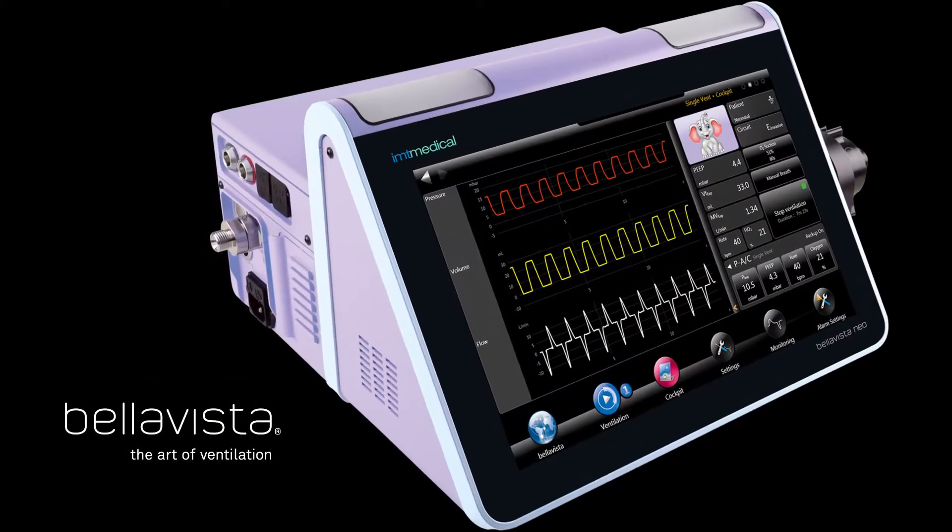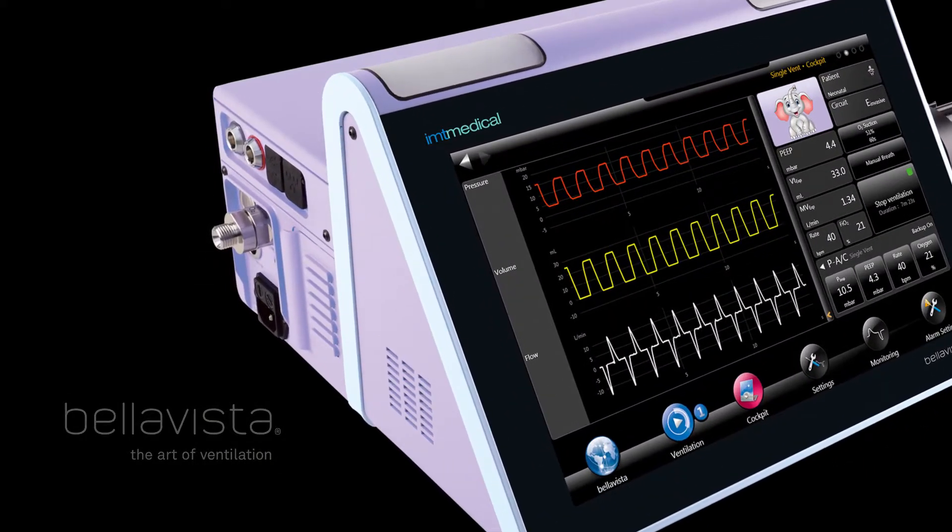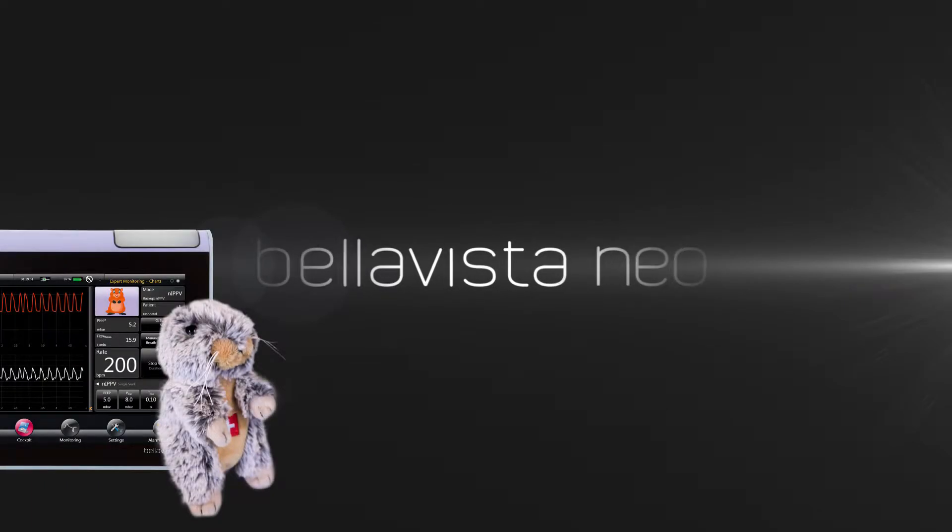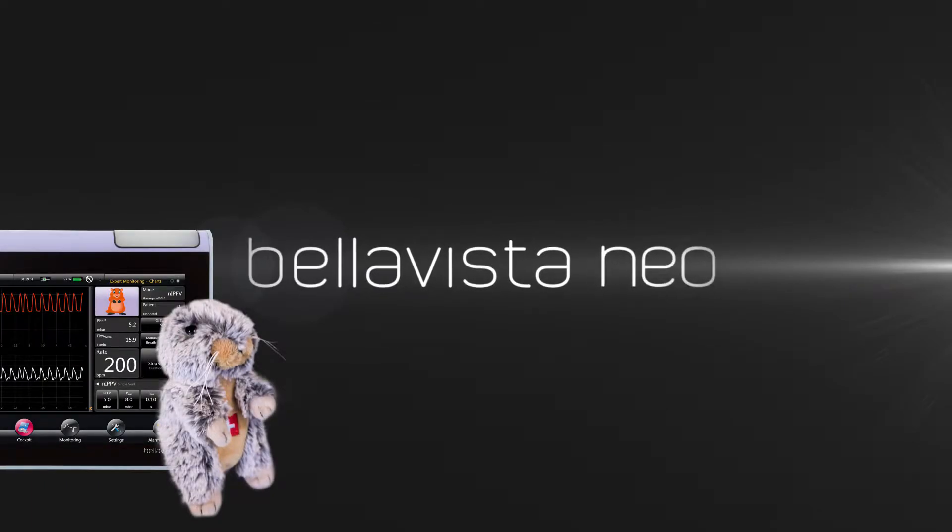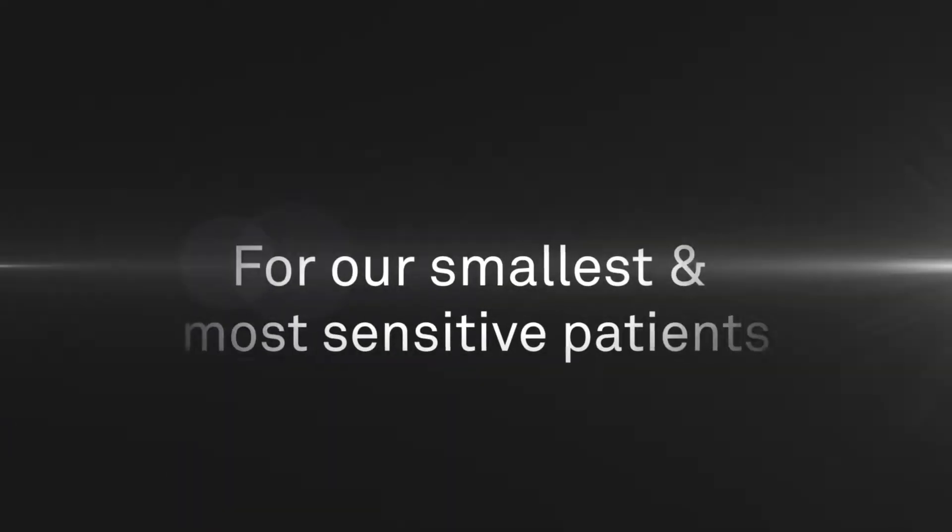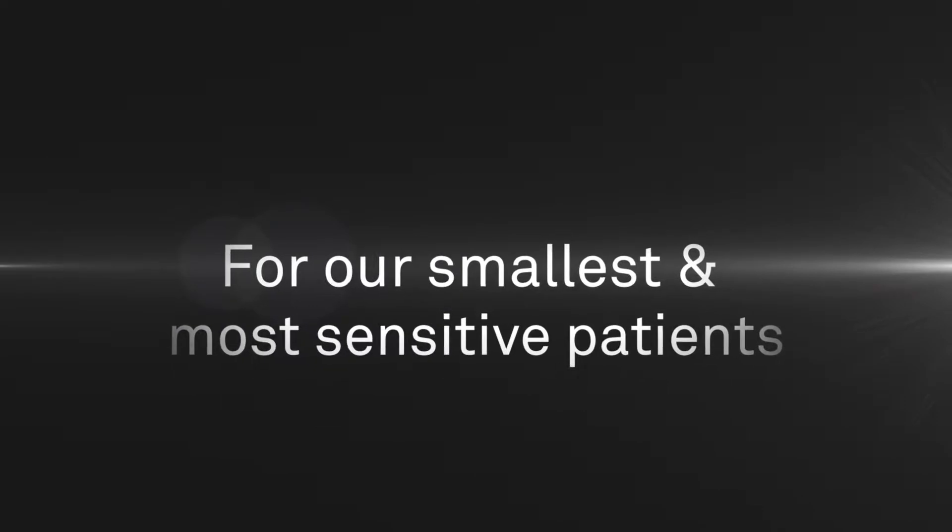One of the most demanding challenges is to ventilate neonates where you need highest precision in volume and pressure control. BellaVista Neo.